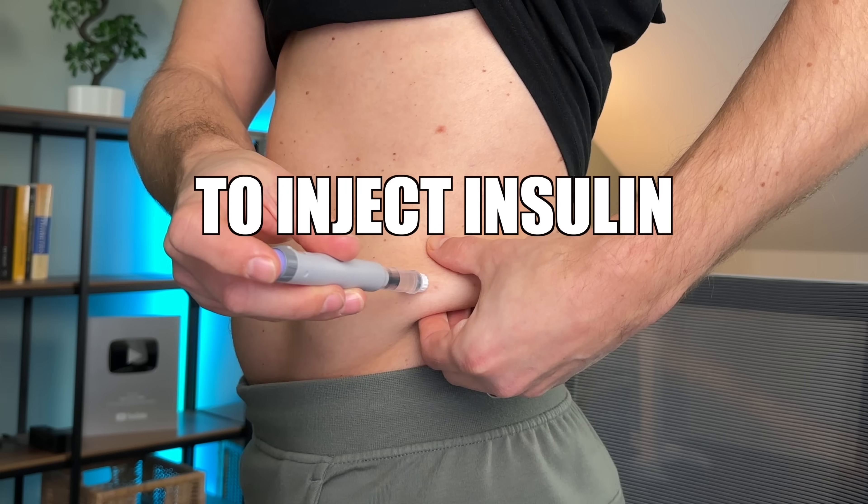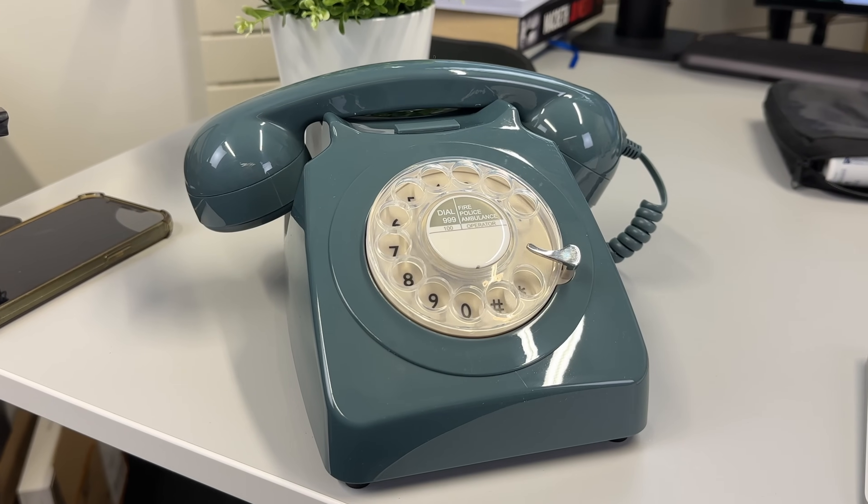If you're using a classic insulin pen to inject insulin, you're doing it wrong. Seriously, it's like using an old wired phone in 2025.